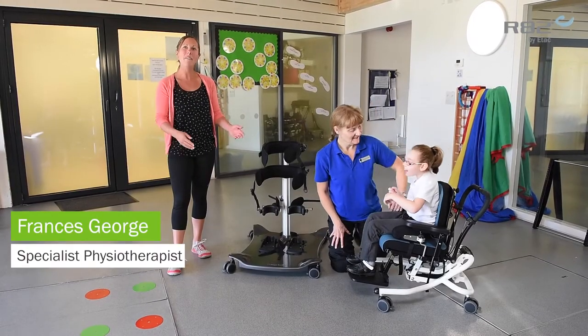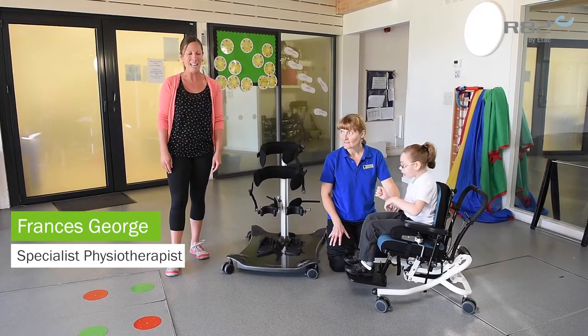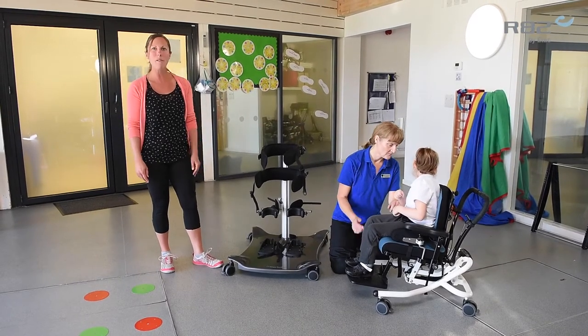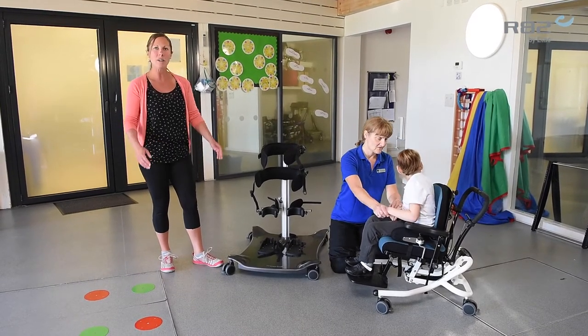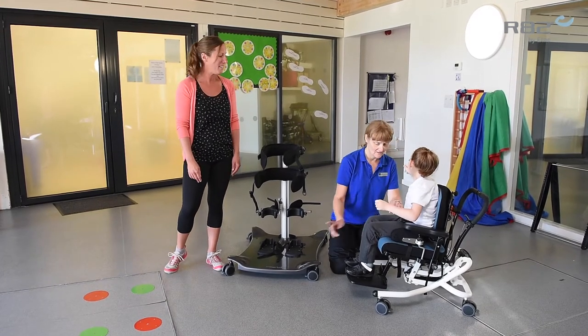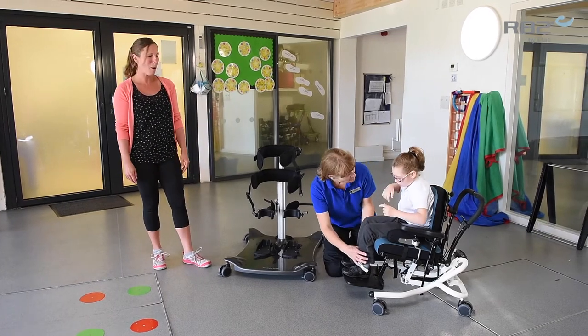Hello, I'm Frances and I'm here to show you how easy it is to transfer into the Meerkat. So I've got with me Michaela, who's one of my teaching assistants, who runs the therapy programmes with the Meerkat standard as a regular part of the therapy programmes. And I've also got Poppy who's going to demonstrate how easy it is to get in. So Michaela's going to start the transfer with Poppy.